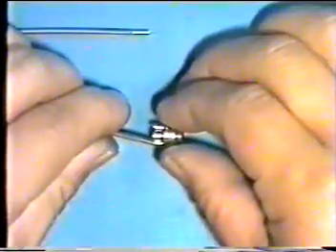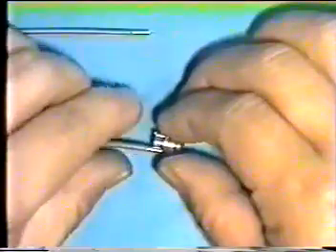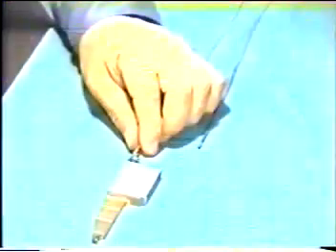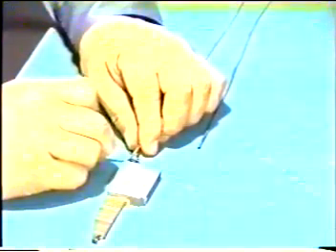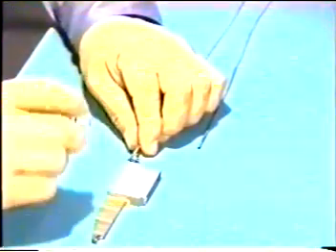How to insert the light guide. Clean the end surface of the light guide and insert it to the bottom of the tip. Press the tip against an anvil or something and bond the light guide with Aron Alpha. Reassembly of air-water tube.